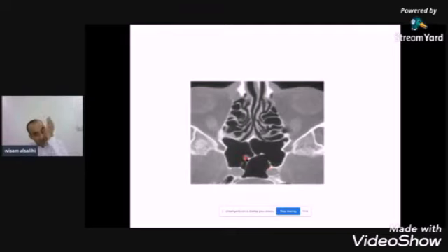So you have to deal with this carefully, because if you pull this septum with any instrument, you may cause injury to the carotid artery and severe bleeding. This is one of my patients with a schwannoma reaching the sphenoid sinus. See how the carotid is near to my instrument here.